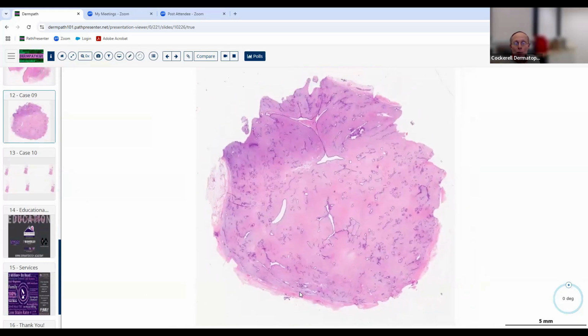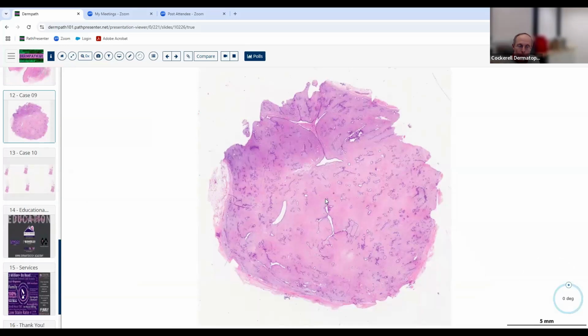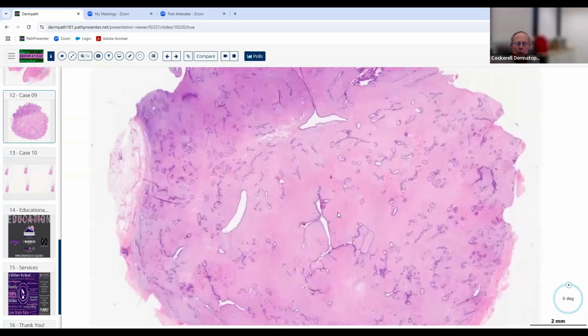Okay. Another lesion that was removed by an incisional biopsy, like an enucleation. This is probably one that you're less likely to get on the board examination, but we're showing you some of these different differentiations again. At low magnification, it's got mostly stromal changes with some epithelial. The last one, everything was epithelial with minimal stroma. The Trichoepithelioma had a lot of stroma with a lot of epithelium. Here we've got mostly stroma with a little bit of epithelium. So this has got some epithelial component, but it's largely non-epithelial.